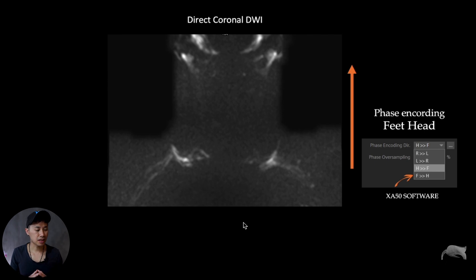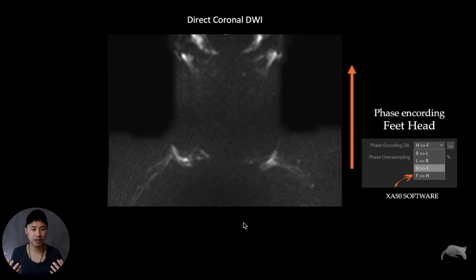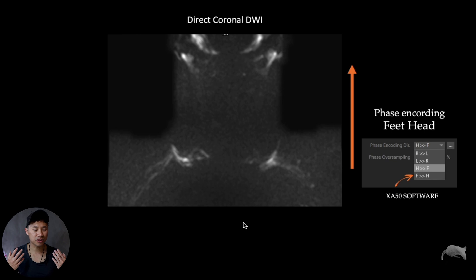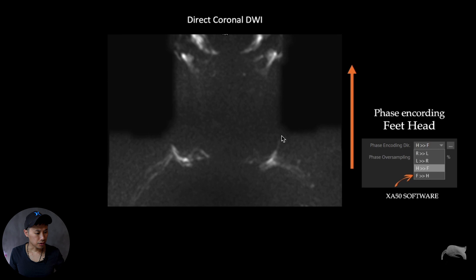You're doing this in direct coronal diffusion, and for this area you need to use a STIR. Without the STIR you don't stand a chance. The reason for STIR is that you get good background suppression — you want to suppress everything and highlight the nerves. If you use a standard fat sat or SPAIR technique, it's very difficult and you won't get good fat suppression. So STIR is the way to go.